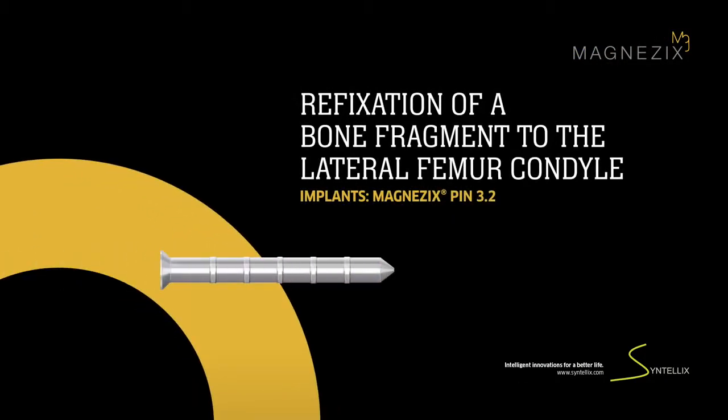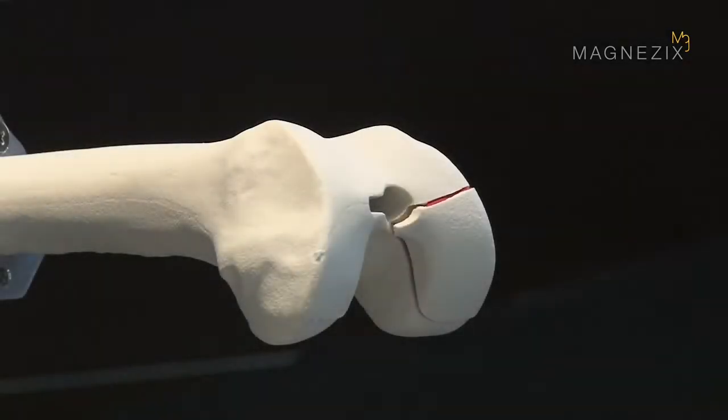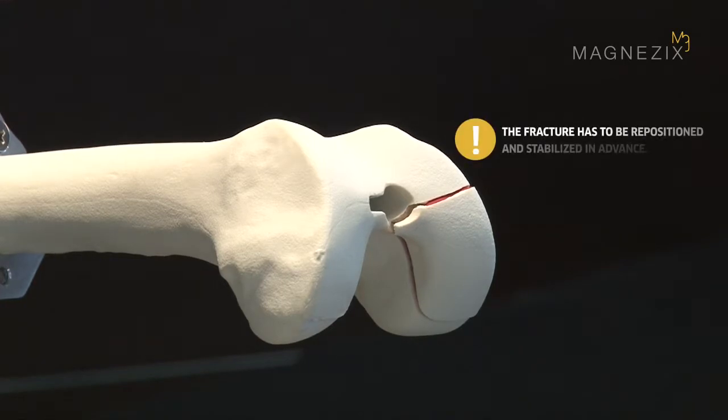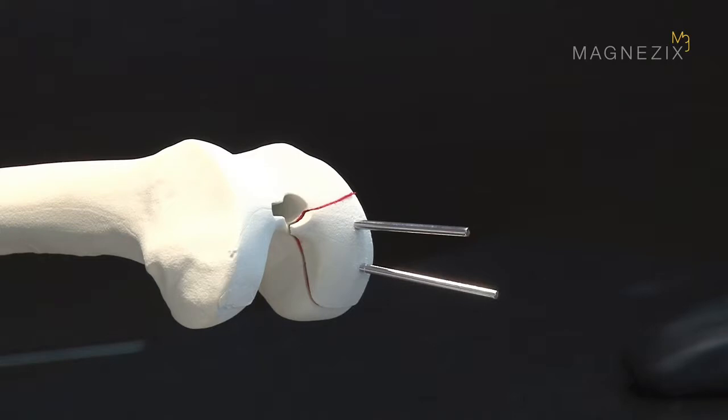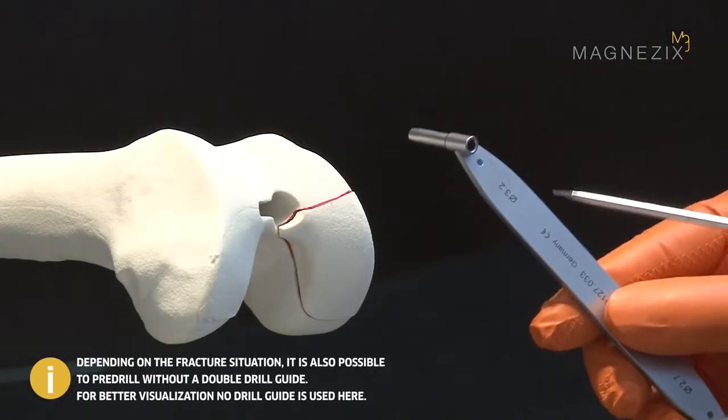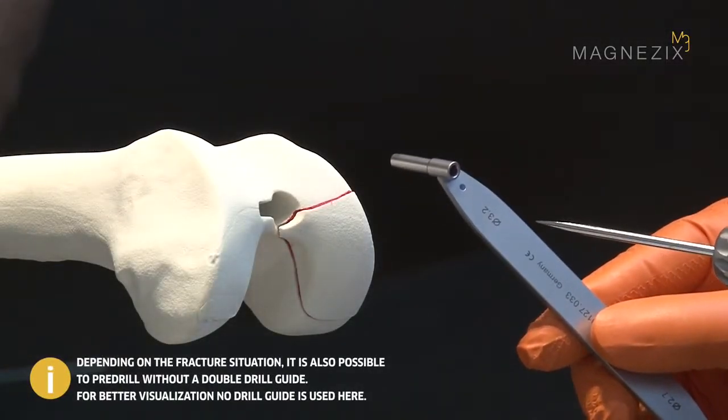This video describes the treatment of an osteochondrosis dissecans to the lateral femur condyle using two Magnesix 3.2 pins. Before the pins can be implanted, the fragment has to be repositioned and temporarily stabilized. Two reduction wires are used for repositioning and pre-drilling the implant bed. The reduction wires are inserted into the bone through the double drill sleeve.